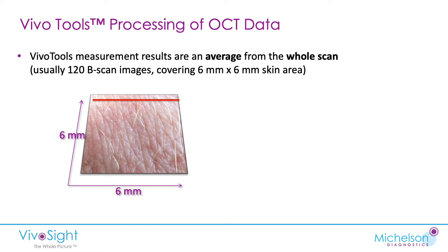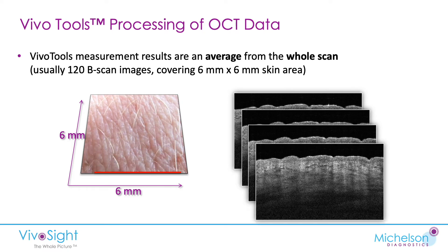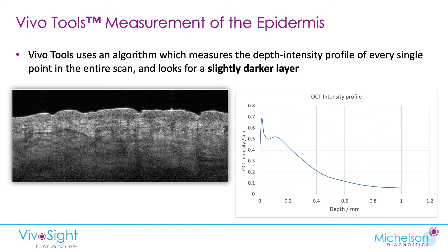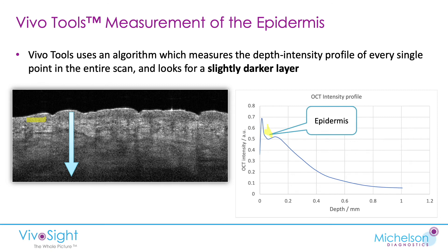Let's review the measurement of skin with the VivoTools. We look at the whole scan and extract the measurement of epidermal thickness across the whole stack. It uses an algorithm that measures the depth intensity profile of every single point in the scan, looking for that slightly darker layer. That shows up in the intensity profile as we go from top to bottom — shown left to right in this picture — with increasing depth, where the darker area indicates the epidermis. We measure the boundary at every single point in the entire scan and extract an average.